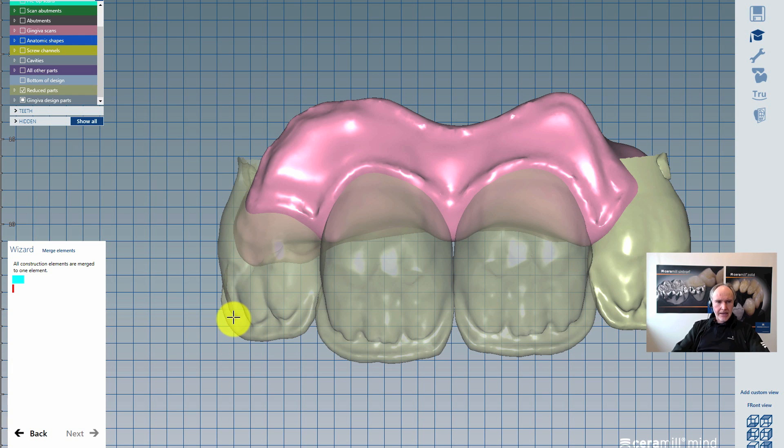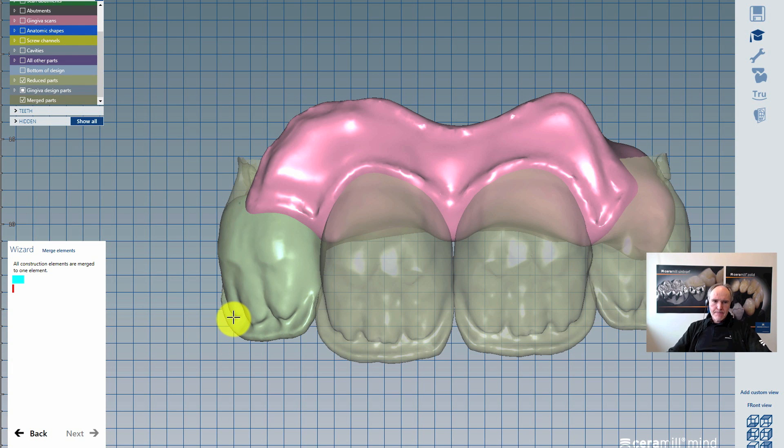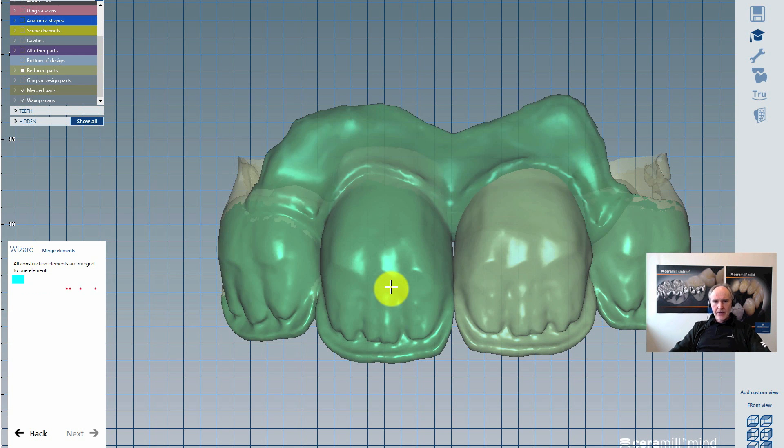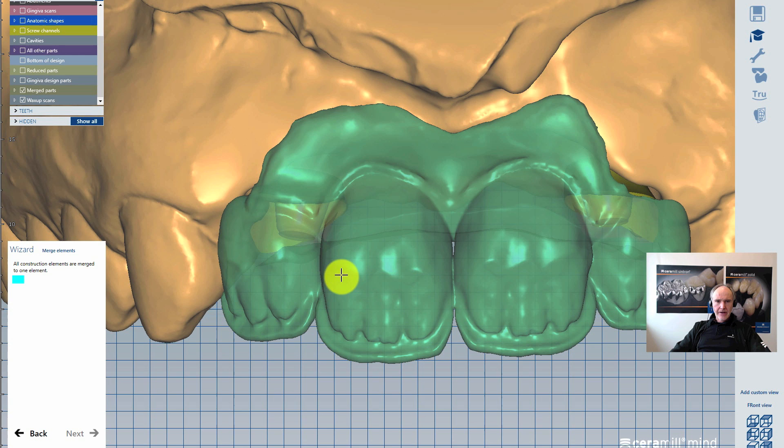This merging is only the merging procedure between the Knut cutback teeth and our gingiva. We will have a second merging in the next step, which will take care of the screw holes and screw channels. The merged parts are now possible to free form. Sharp edges around the profile line — I could take the flatten tool and go around a little.